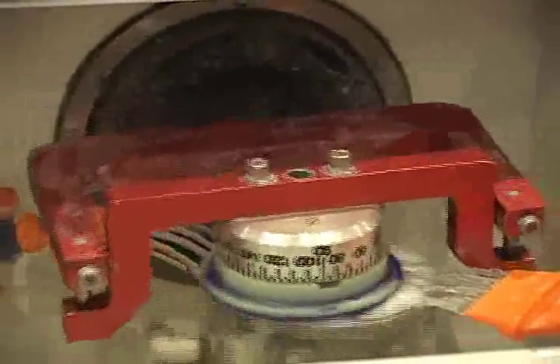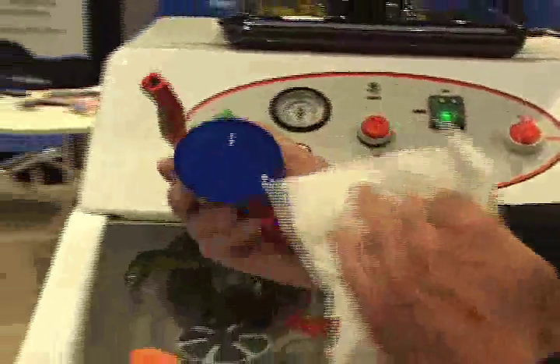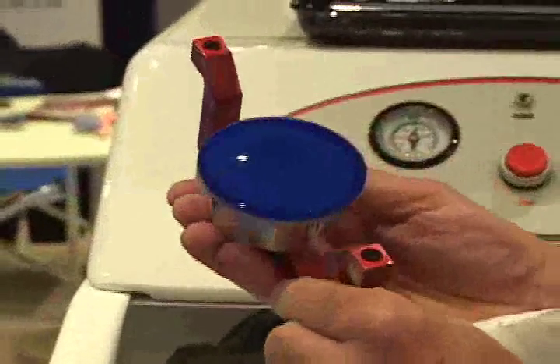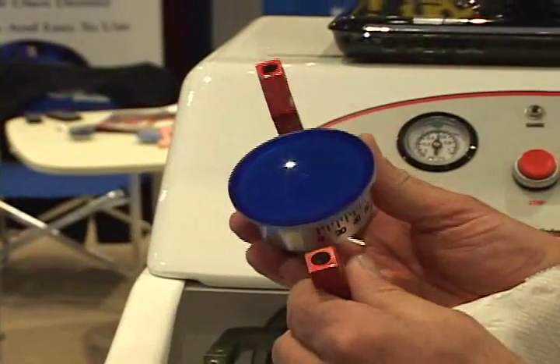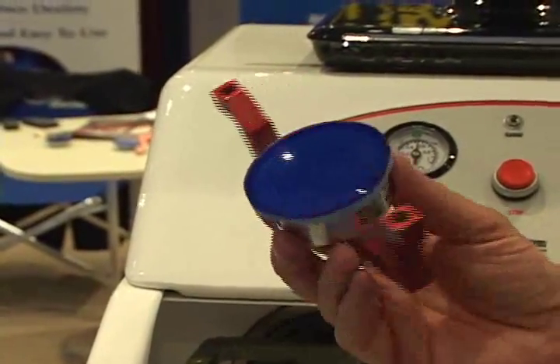And now the water will come on just to clean the lens so there's no mess when you take it off. At the end of the cycle, we just inspect it for scratches. And as you can see, we have a beautiful surface. We're ready to de-block the lens and put it on our edger for dispensing.